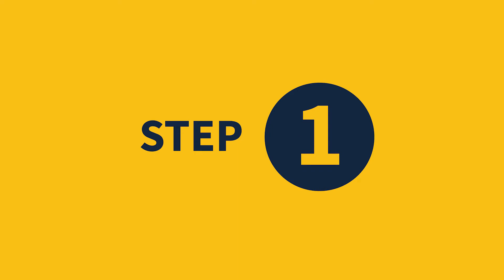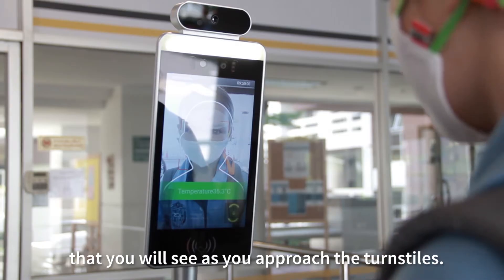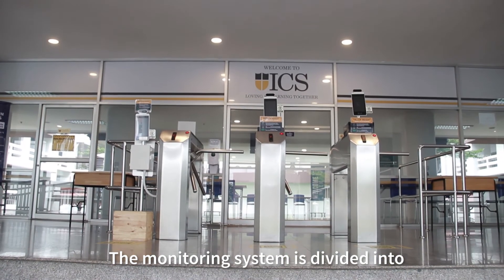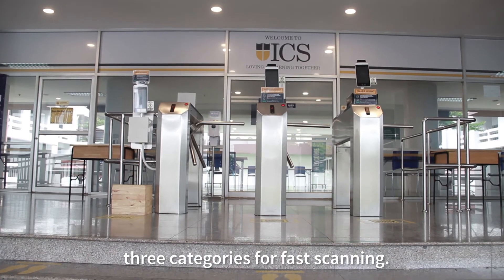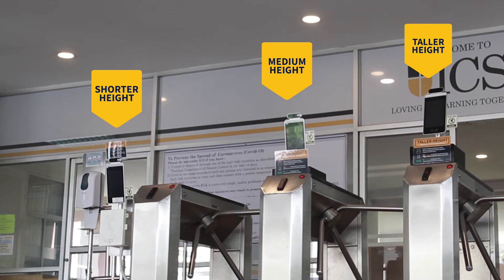Step one: we have placed a temperature monitoring system that you will see as you approach the turnstiles. The monitoring system is divided into three categories for fast scanning — the shorter height, the medium height, and the taller height.